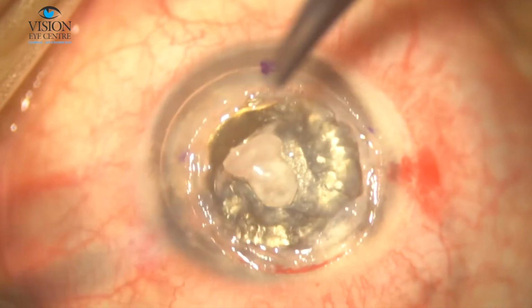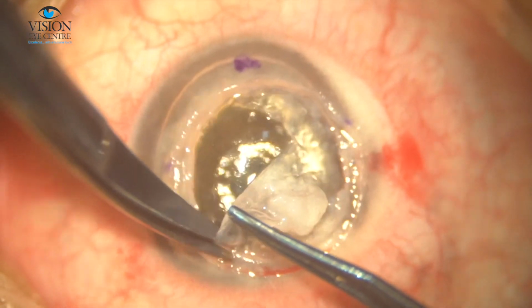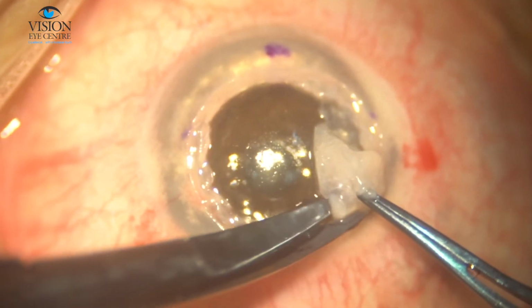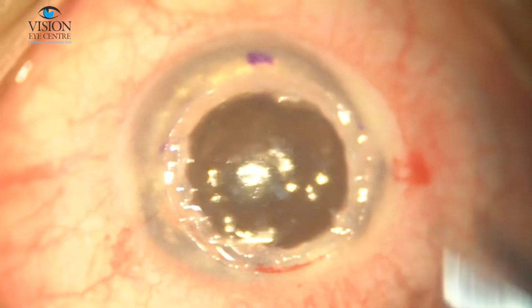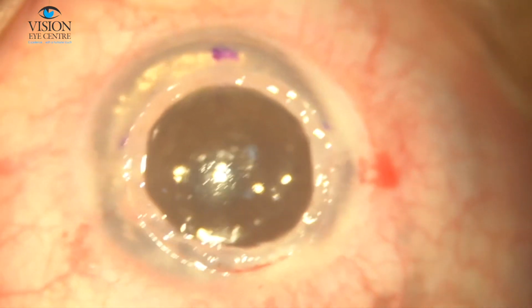So after careful dissection, we've reached a point where the cornea is extremely thin but clear. So this is the stage where we would want to stop and excise the residual stroma anterior to it. Just trim the edges so that we get a regular interface, and following that we would go ahead and place the graft.